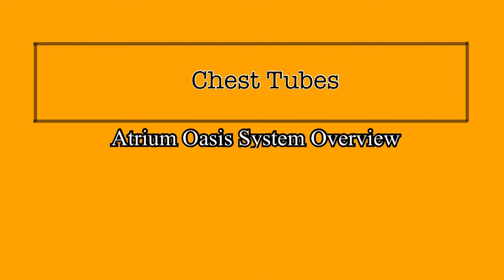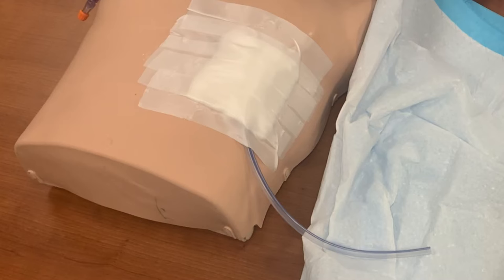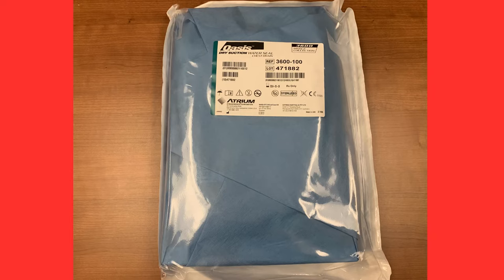The Atrium Oasis Dry Suction Water Seal Chest Drain System is the device utilized at St. Mary Mercy Hospital to maintain chest tube drainage. This video will provide an overview of the features of this drainage system. The chest tube will be placed by a physician, possibly at the bedside, but likely during a procedure. The Oasis drainage system is what the nurses on the inpatient units will need to know how to manage for their patients with chest tubes in place.